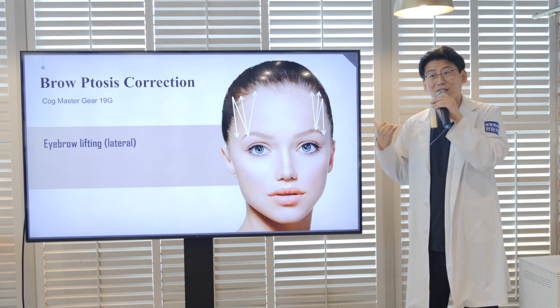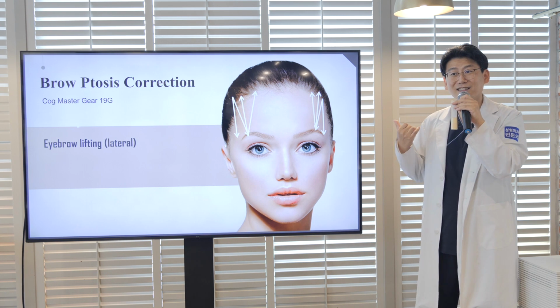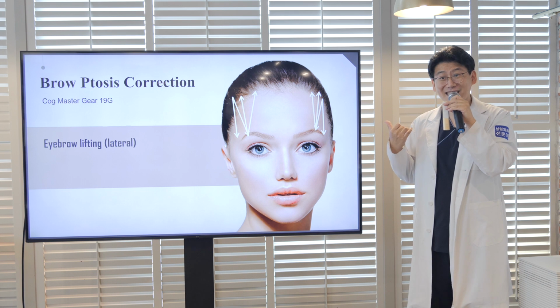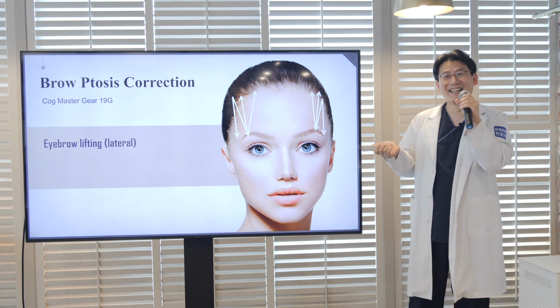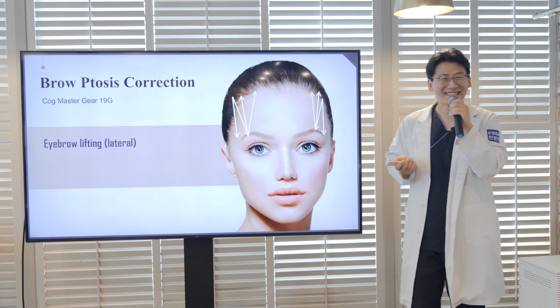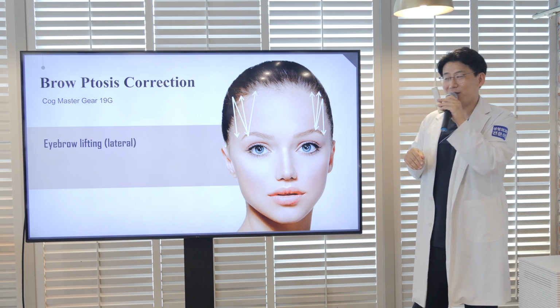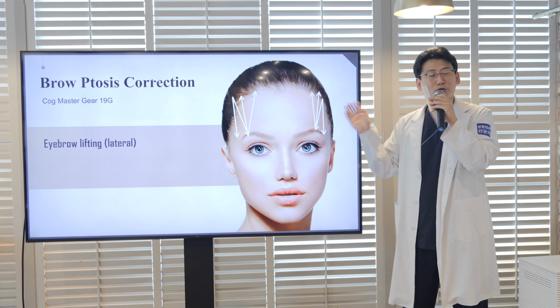It's very famous as foxy eye. Sorry, but Koreans don't like this. Originally we have foxy eye. So actually in my country I should insert here and here as well, together.